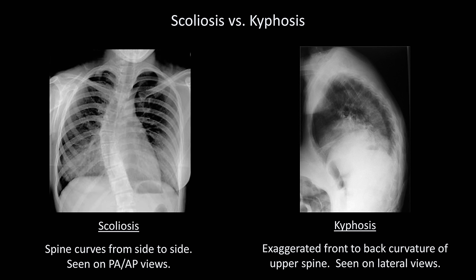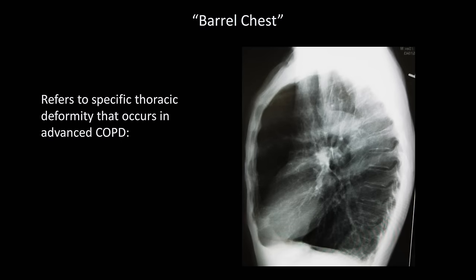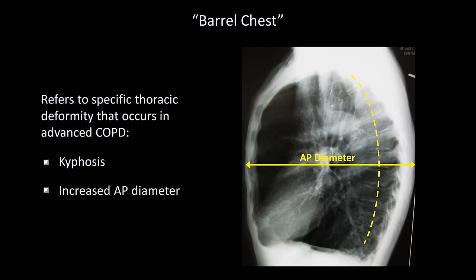A specific form of kyphosis is seen in the barrel chest deformity, which can occur in advanced COPD. This consists of the combination of kyphosis and an increased anterior-to-posterior diameter of the thorax. When the AP diameter approaches that of the side-to-side diameter, the thorax begins to resemble a wooden barrel. You can also appreciate the flattening of the diaphragms this patient has from his COPD.